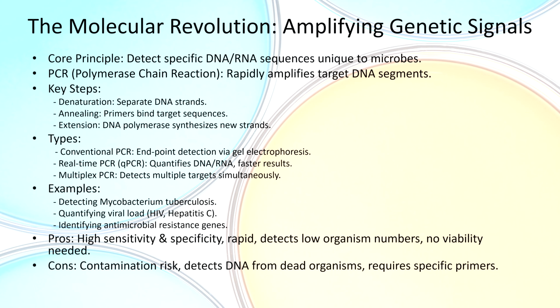This technique is highly sensitive and specific, fast, and doesn't require live organisms. But it risks contamination, and it can detect DNA from dead microbes, which may not indicate active infection.